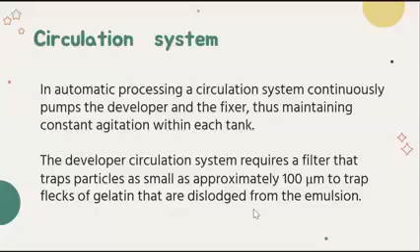And also, agitation aids exposure of the emulsion to the chemical. So it allows even exposure of the chemicals in the film, so that the exposure of the developer or the fixer or the wash to the film is uniform. And the particles thus have less chance of becoming attached to the rollers because of the circulation system and, of course, the 100 micrometer filter, okay, where they can produce artifacts.